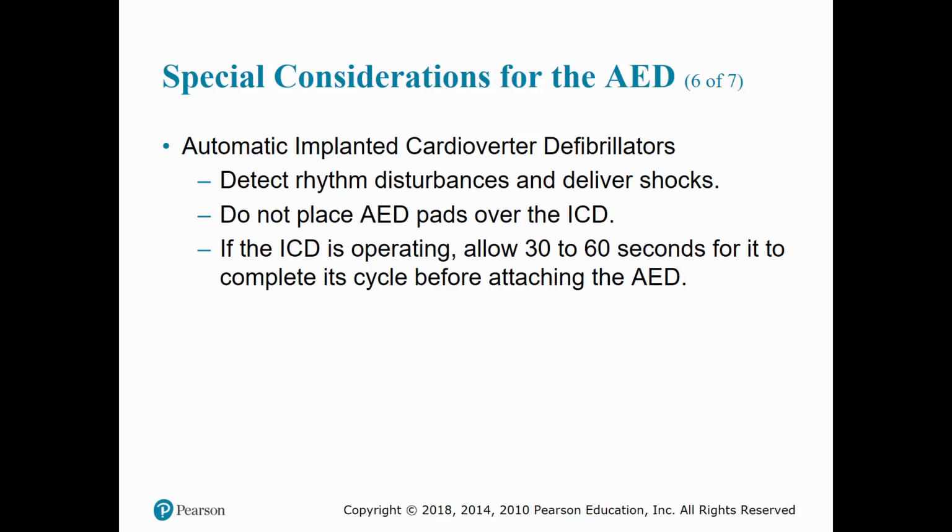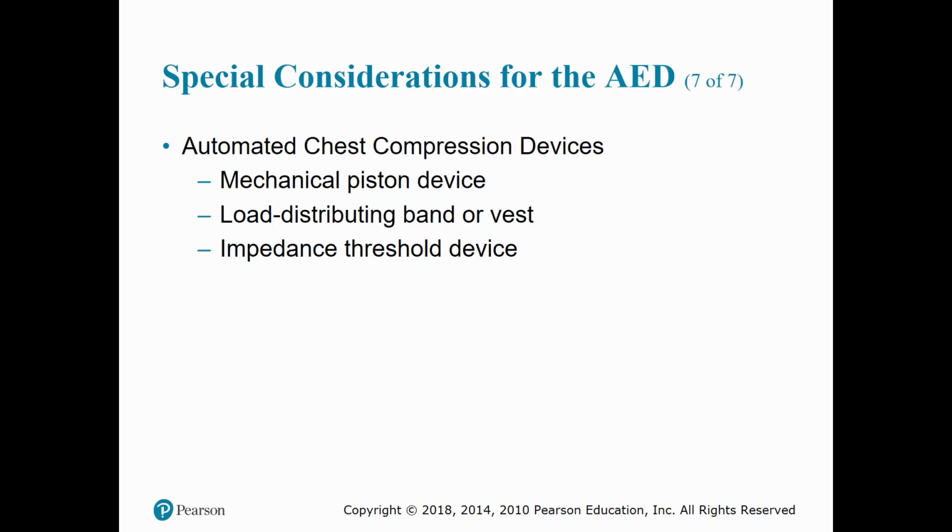Alright, just a couple special considerations. Automatic implanted cardioverter defibrillators detect rhythm disturbances and deliver a shock. Do not place AED pads over the ICD. If the ICD is operating, allow 30 to 60 seconds for it to complete its cycle before attaching the AED.